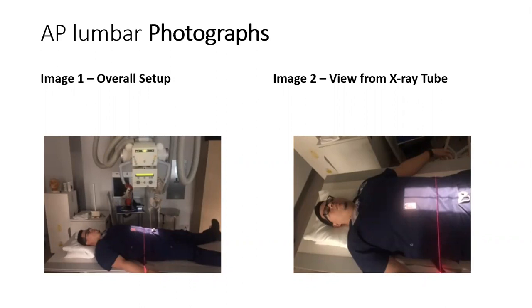I greeted the patient upon his arrival. When I first made contact with the patient, I verified his name and date of birth. I asked the patient which part of his body was bothering him. The patient replied that it was his lower back that had been causing him a lot of discomfort for the past few days. I asked the patient if he needed any help getting to the X-ray examination table. The patient replied that he didn't need any help and was willing to do everything on his own.